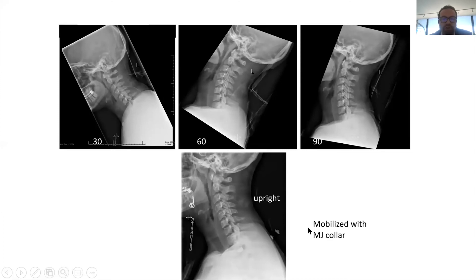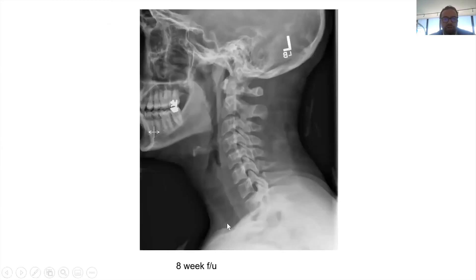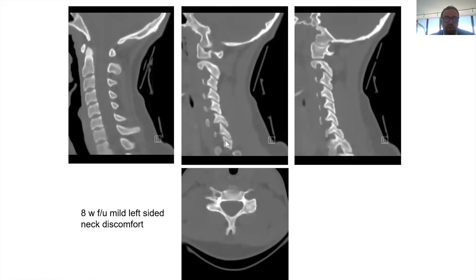We typically use a Miami J collar — there are different collars to use. With nothing subluxing and neck pain managed, you treat them this way for about eight to twelve weeks. At the 12-week follow-up, there's no subluxation, no neck pain, and a CT scan demonstrates that the fracture has indeed healed.